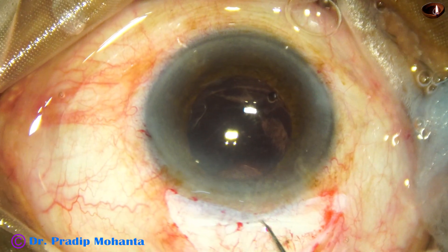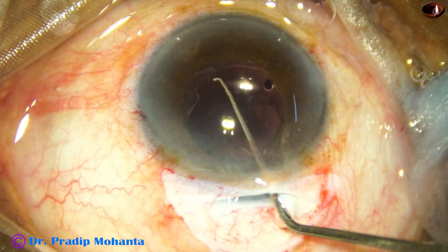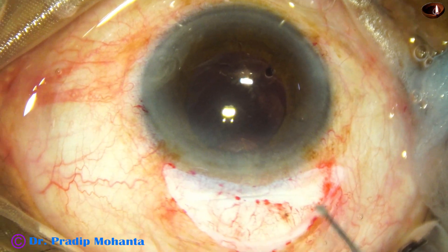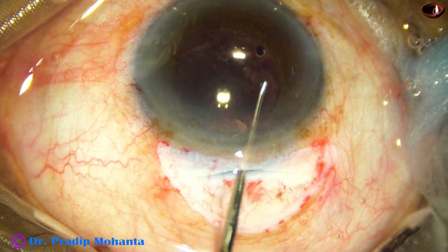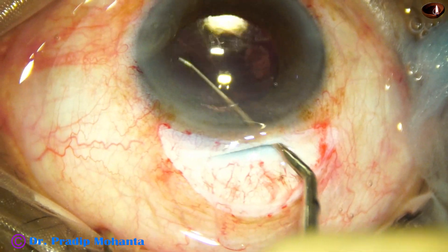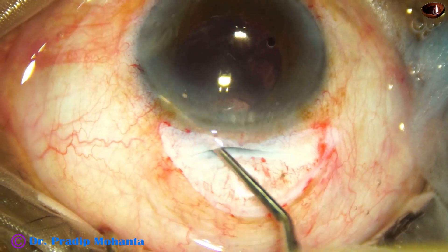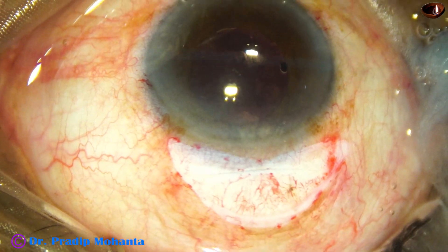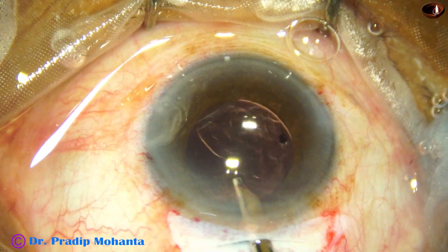See the wound — the wound is nicely opposed. When the wound is nicely opposed and there is no gaping, astigmatism is very minimal — within about 0.75 or 0.5 diopters of induced astigmatism. This is achieved when the main wound is not gaped and the two wound margins are nicely opposed.